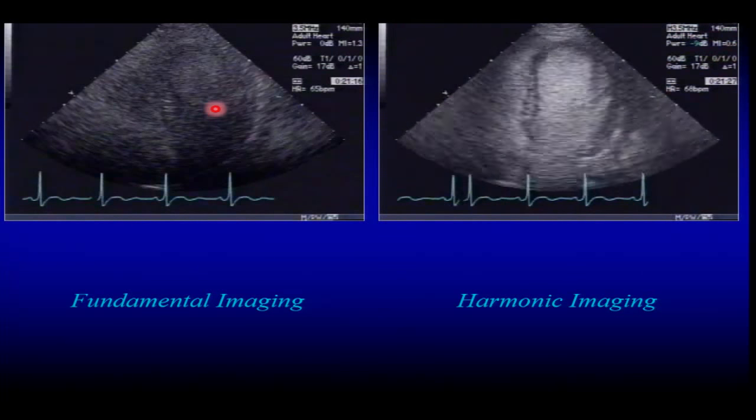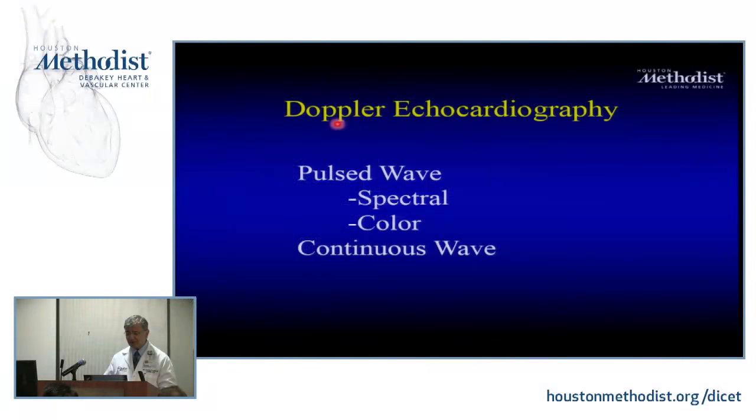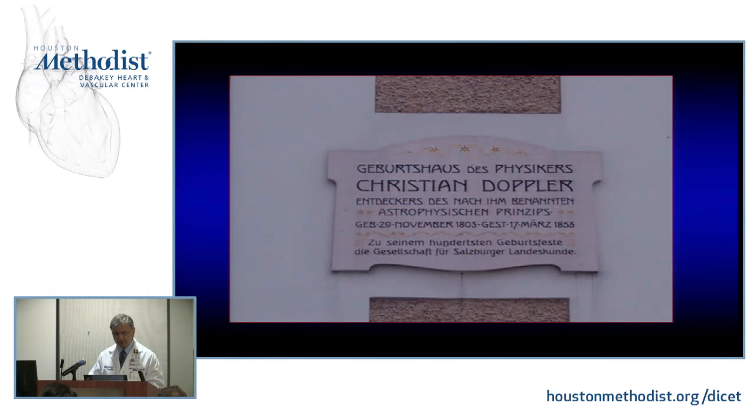We're done with 2D and M mode. Let's talk about Doppler, okay? Now, Doppler, interesting. Christian Doppler lived and died long before we were even conceived. We're talking about the 1800s. That's where he lived, in Salzburg, Austria, and this is what's left from his birthplace.